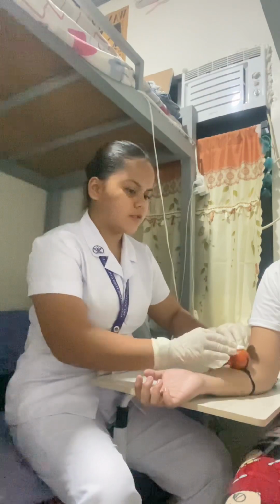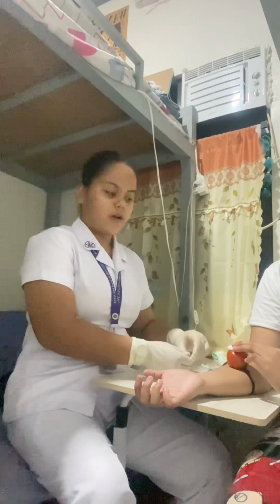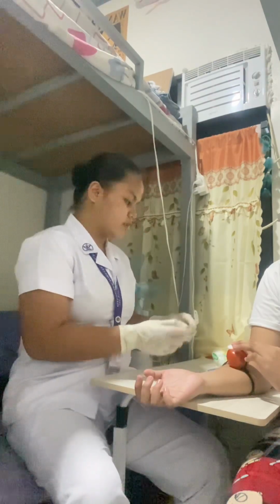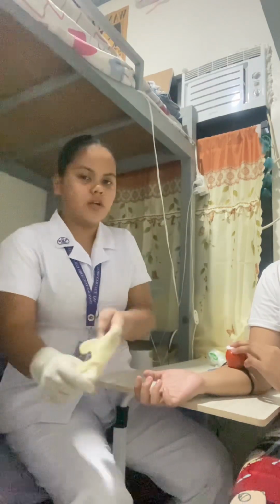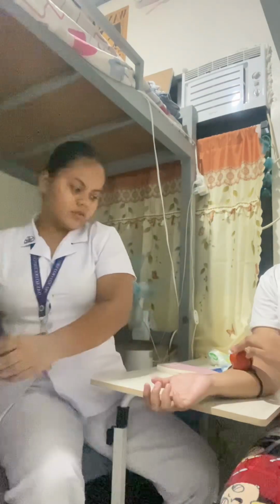So ma'am, can you hold this for me? Okay, thank you very much. So now I'm going to discard the needle that I have used into the right container, and then remove gloves, discard the gloves, and apply hand hygiene.